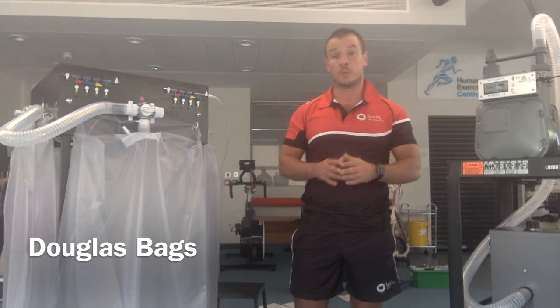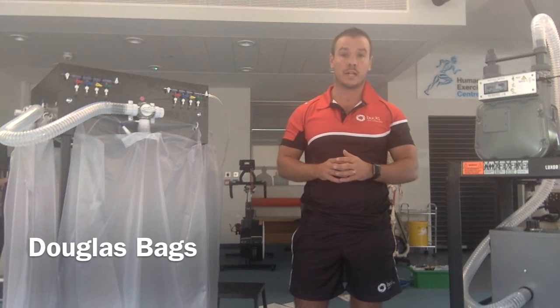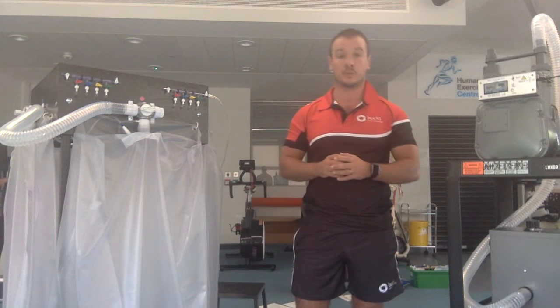Now that you've set up your power lap and calibrated your gas analyzer, we're ready to set up the Douglas bags.